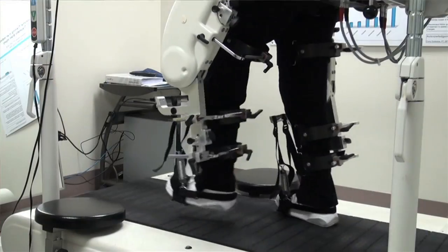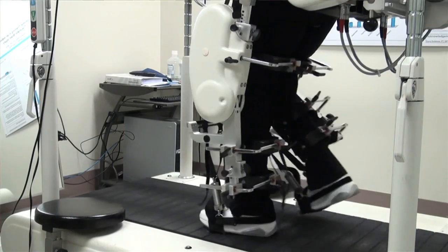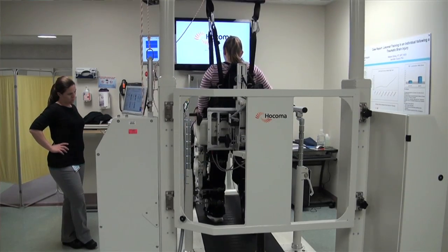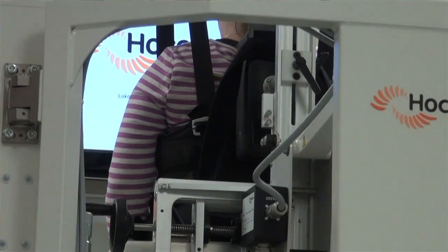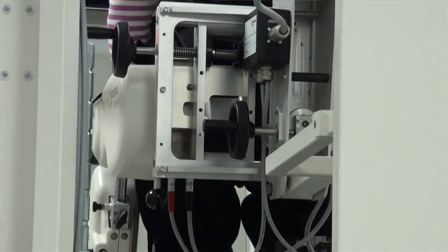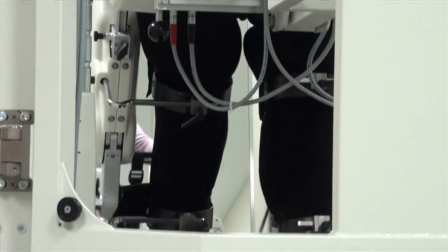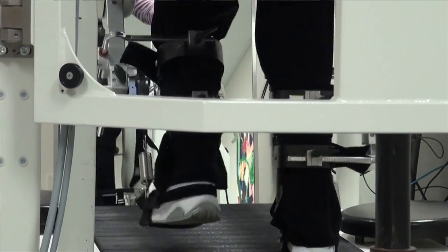We walk people for about 20 minutes. With conventional physical therapy — regular overground walking with a therapist — you get in about 50 steps in the course of 20 minutes. On this machine we're getting in a thousand steps in that same time frame, so you're getting more intensive repetitions with the same exact pattern over and over again.